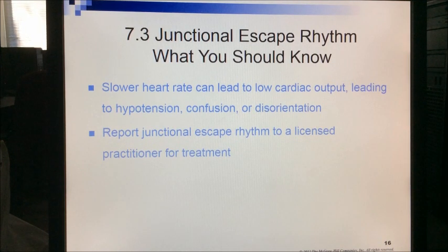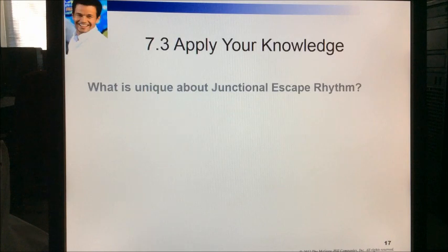Okay, so if you have a patient and every single beat that they have has a negatively deflected P wave, that lets you know their SA node is not firing at all whatsoever. So you have got to let a doctor know immediately so the doctor can jump in and intervene, especially if it was something that was not previously noted on previous EKGs.